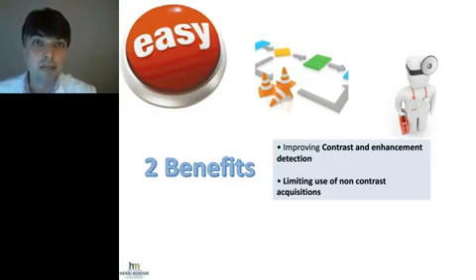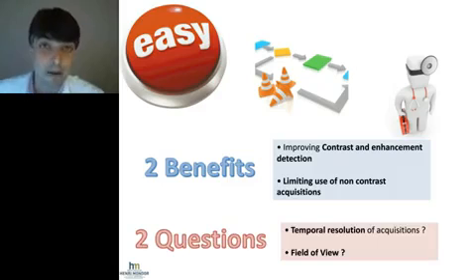And if you get rid of that non-contrast phase when it's needed, well, then you reduce the dose to the patients. Second benefit or potential benefit of spectral imaging. And of course, there were two questions with that.